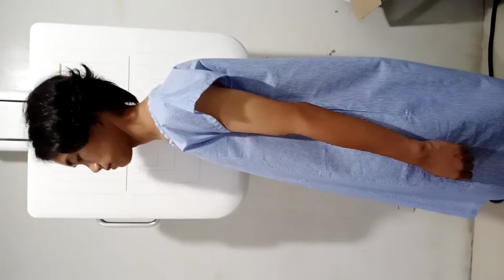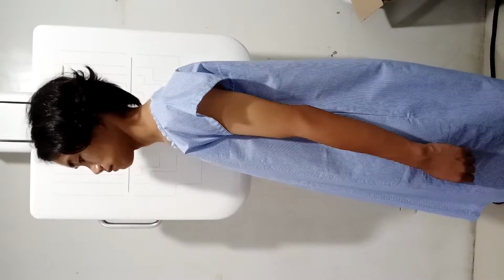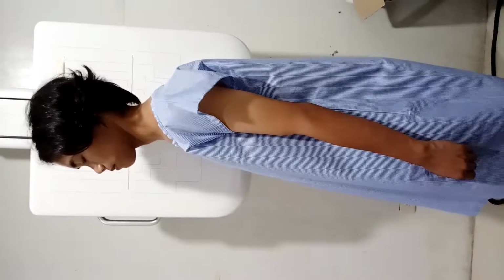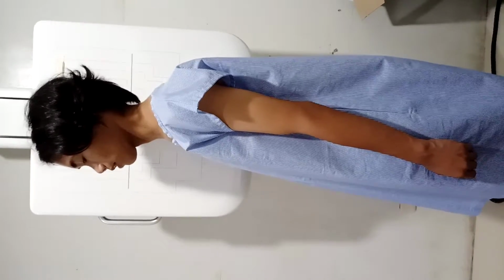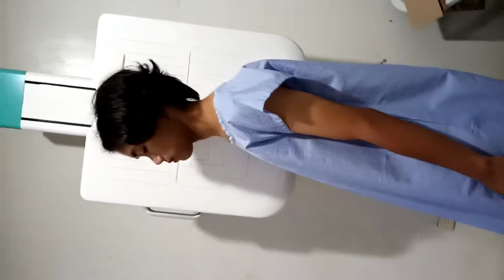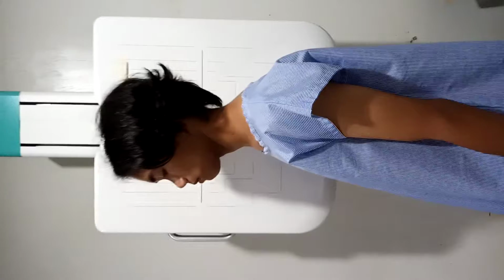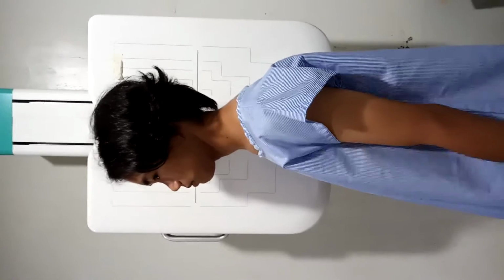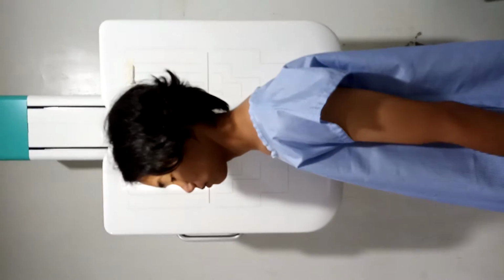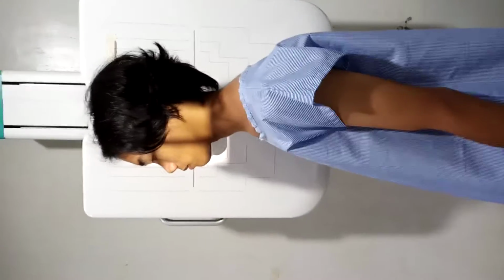The central ray must be horizontal and perpendicular to the IR, entering C4, the cervical 4. The SID that we're going to use is 72 inches or 180 centimeters, as recommended. Then in collimation, adjust to 10 by 12 inches or 24 by 30 centimeters. Then place the marker in the collimated region. So the central ray must be perpendicular to the mastoid tip.